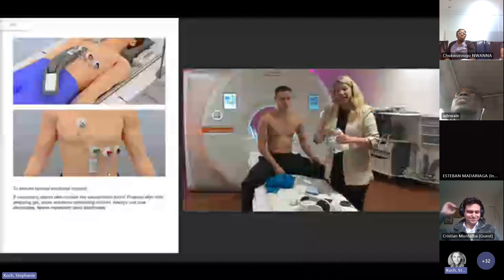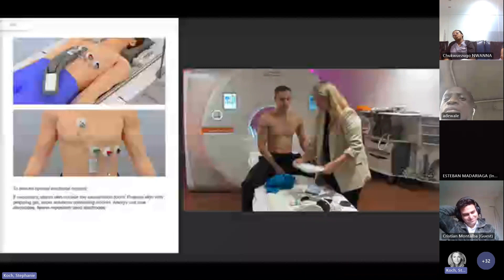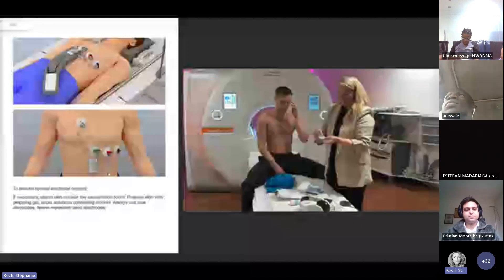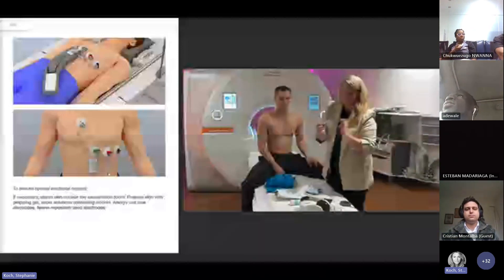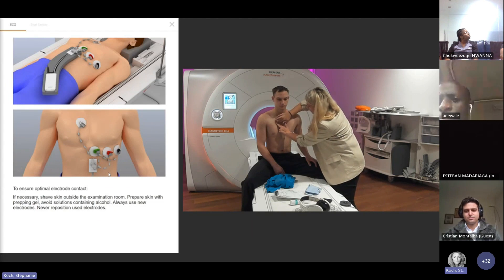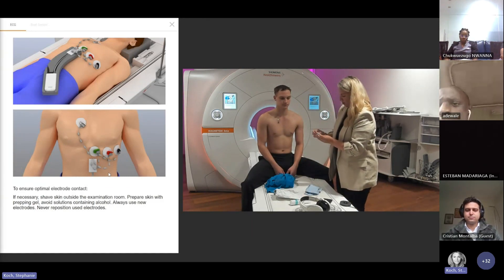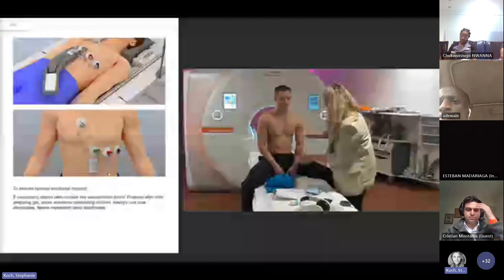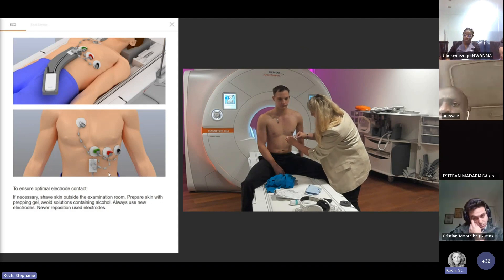Then we have our electrodes here, and I only need four of them. You need to be careful that you don't touch the sticky part. I only position my electrode and then press it properly on with my fingers. I can also see here where the part goes down.